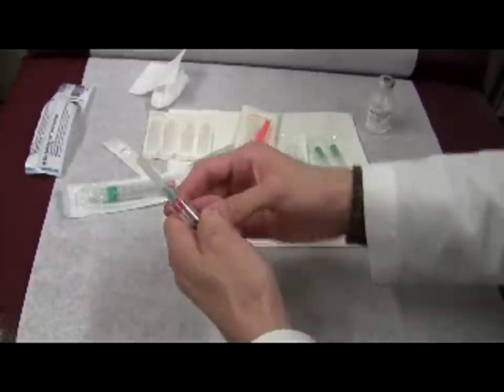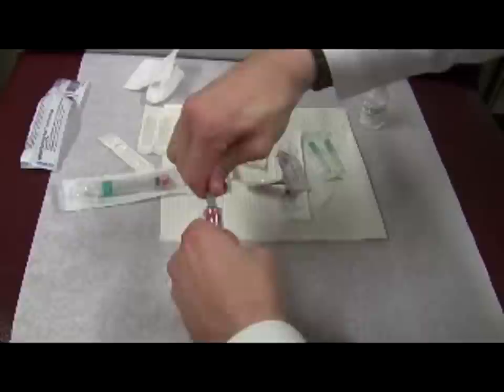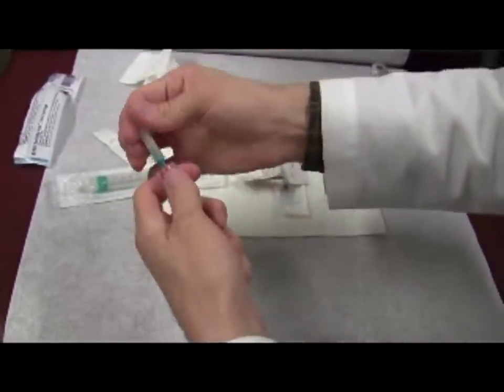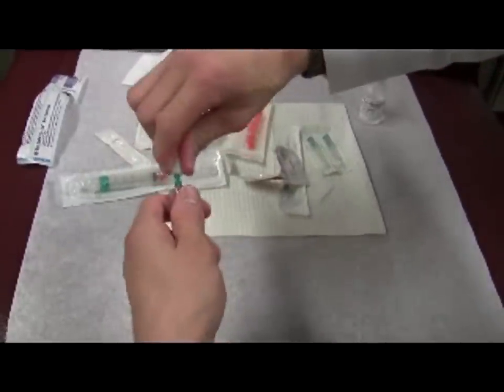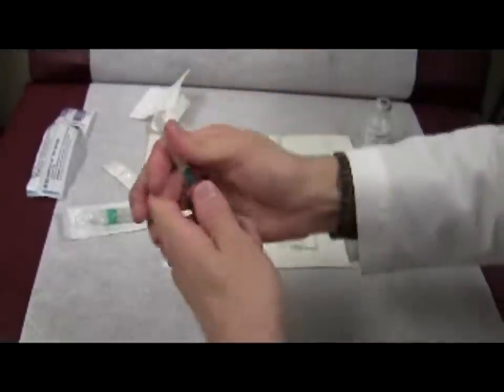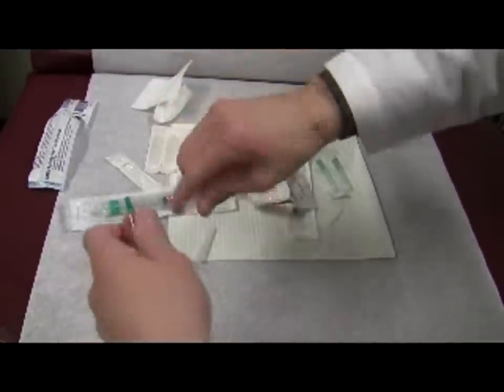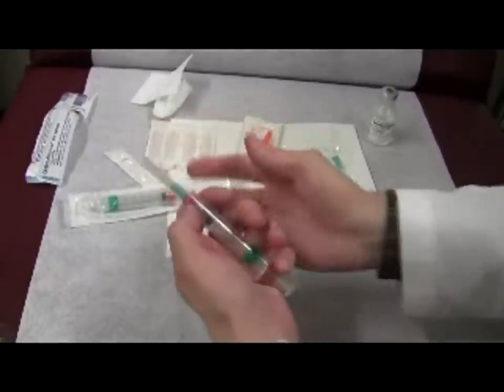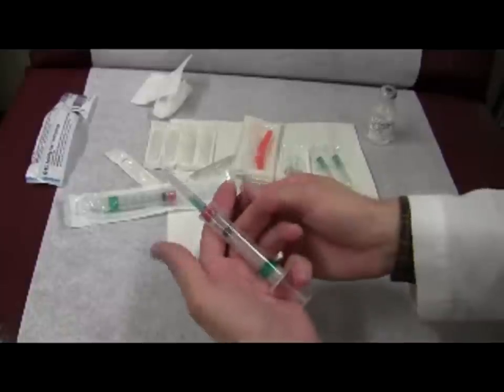Unscrewing the needle when the cap is not snapped on can result in the cap unexpectedly coming off and result in a needle stick. If this isn't on fully and you're twisting and it's not coming off because it's not grabbing, the cap can twist off and you can cut yourself. So keep in mind: if the needle does not come off readily, discard the syringe, medicine, and attached needle, and start over.